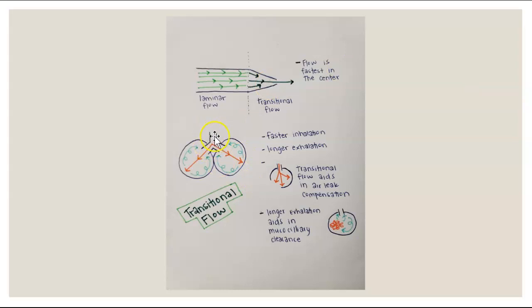And again, I told you guys in the high frequency oscillatory one, I'm sorry about my pictures. They're just the easiest way to explain it. So here's some lungs. In that transitional flow, what's happening is we're jetting to the distal portions of the lungs, to the distal airways, going fast, jet, jet, jet, jet. And then that slow flow on the outside, and the fact that we're not pulling that breath out, is that passive exhalation. So we're going nice and slow on the way out.